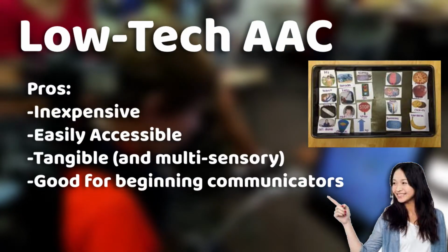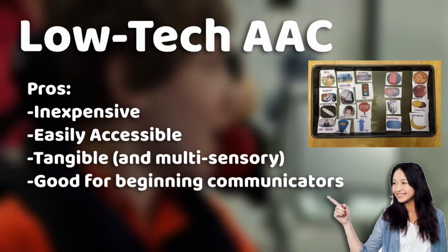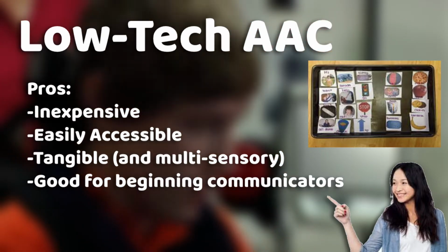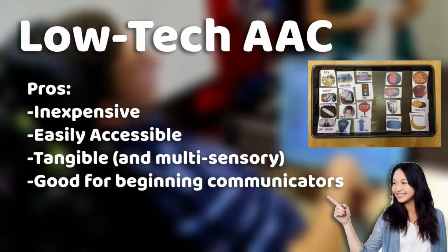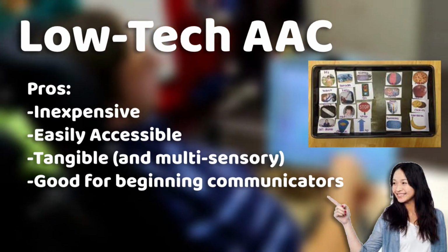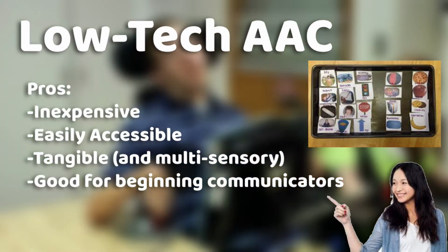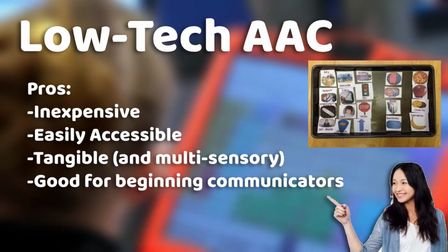Using a low-tech AAC device has many pros, biggest of which is they're very inexpensive to make. They're very easily accessible and they're tangible and multisensory because they're very hands-on. They're also very good for beginning communicators. Using a few relevant pictures or core words that relate to an activity is simple and it doesn't overwhelm the user with a lot of options.